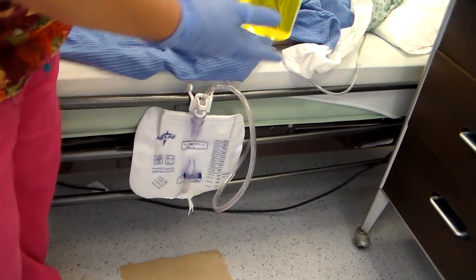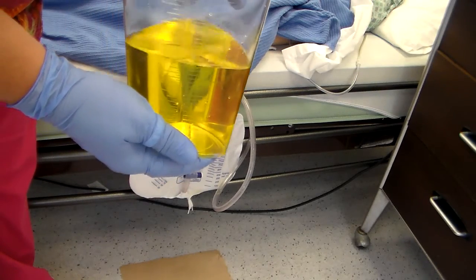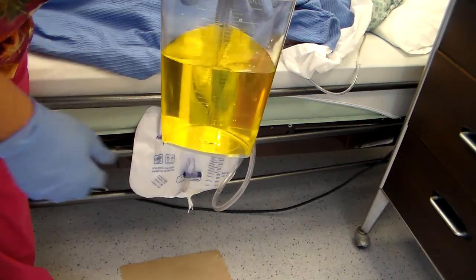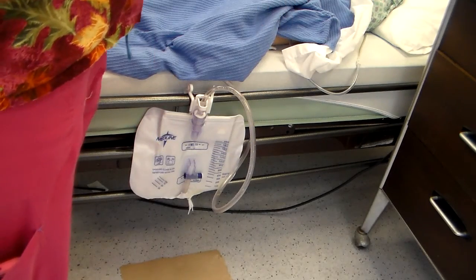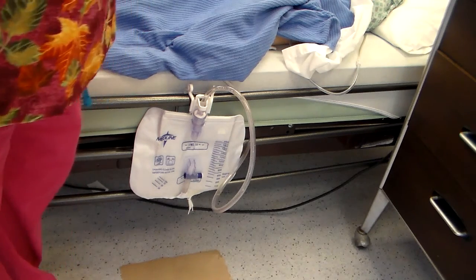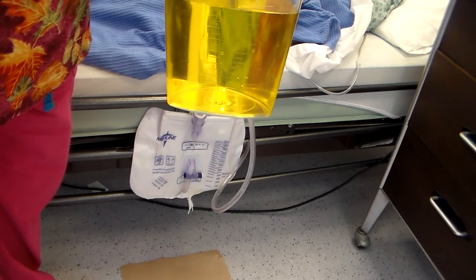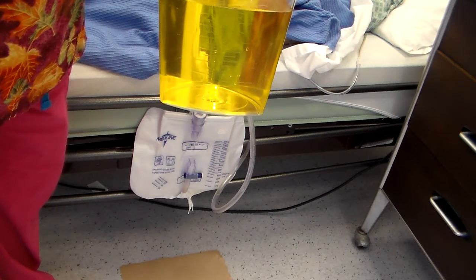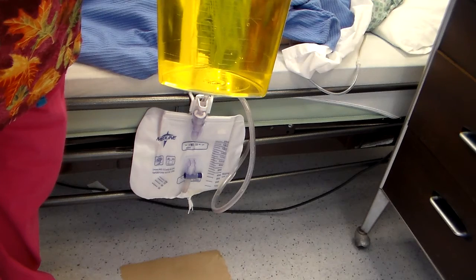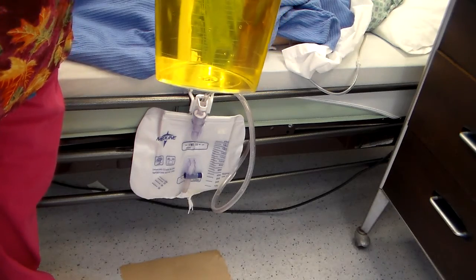Then you're going to pick up your graduated cylinder and look to see how much urine is in it. You can't hold it like this because you're not going to get an adequate reading. You're going to hold it like this right here. How much do you think is there? Let me see. I see 500 milliliters of clear yellow urine. You always want to look at the color and the consistency: clear, cloudy, specks of stuff, blood, sediment. And how much. This is all stuff that we're going to look at.